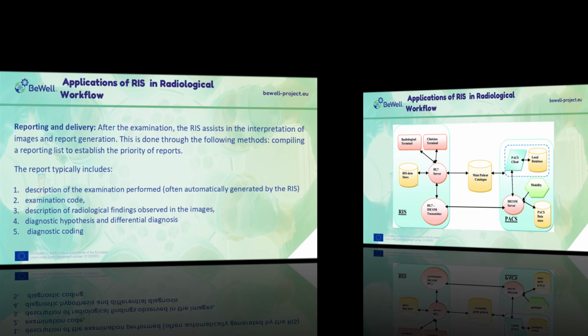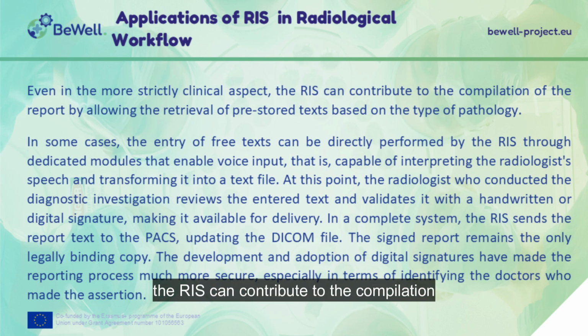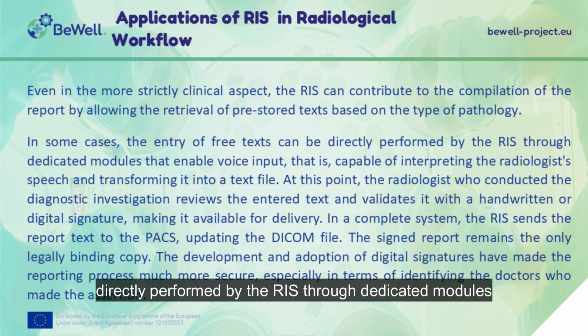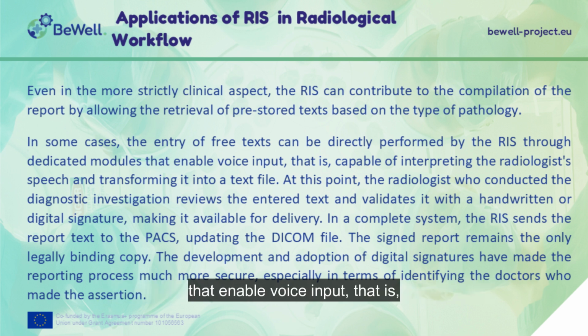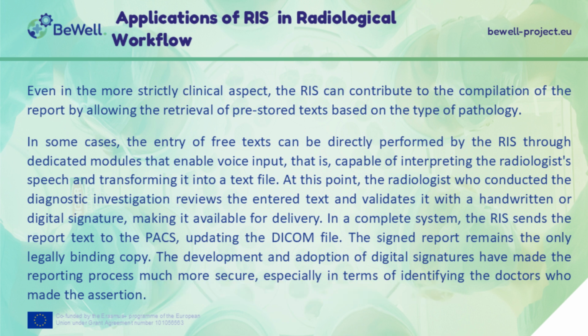Even in the more strictly clinical aspect, the RIS can contribute to the compilation of the report by allowing the retrieval of pre-stored texts based on the type of pathology. In some cases, the entry of free texts can be directly performed by the RIS through dedicated modules that enable voice input, that is, capable of interpreting the radiologist's speech and transforming it into a text file.